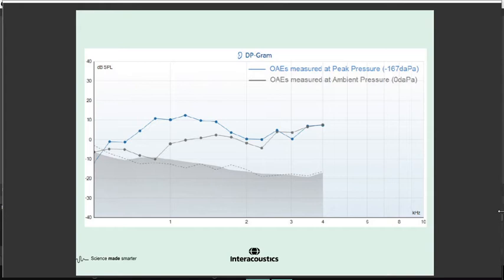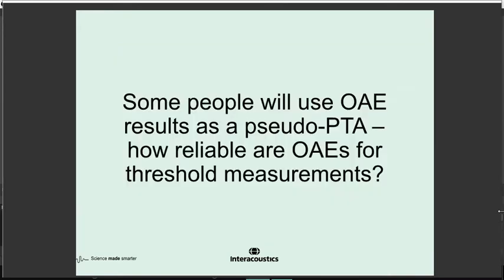now the tympanic membrane moves back to its normal place. It isn't under any extra tension because of the pressure differential, and we do another DP measurement, and we can see that actually the signal level has been elevated by 10 or even 15 decibels because that transmission works more efficiently. And so when patients present with some degree of middle ear pressure offset, the probe allows them to do a quick tympanogram and then shift the pressure to provide an equalized pressure across the tympanic membrane to obtain a result that would have been attained if that patient had not got a pressure offset.